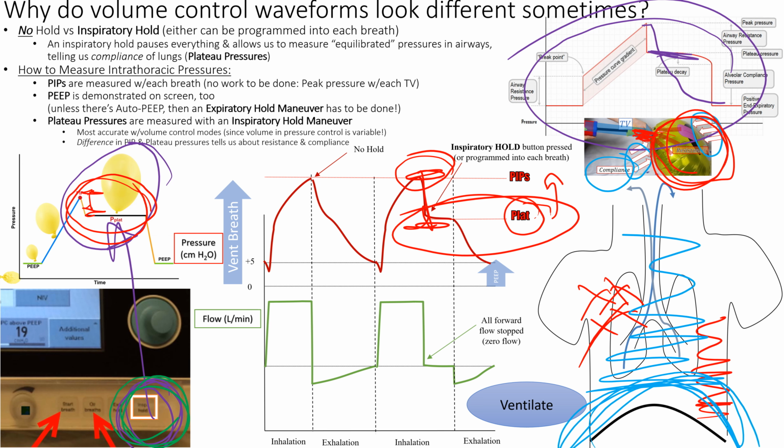Okay, so this inspiratory hold is where we just press the little button and it automatically holds for us. You get a little waveform. On this vent right here, the Servo, at the bottom left, the numbers pop up for you. On the $40,000 Drager machine, it doesn't. It's like, why can't you get this? That should be your one and only thing. That's the most common maneuver we ever do. And you just hit freeze on the machine, and you dial the knob over to be able to measure your waveform. So there's a few more tricks to do for the Drager, unfortunately.